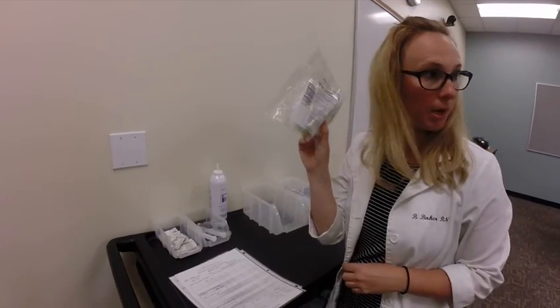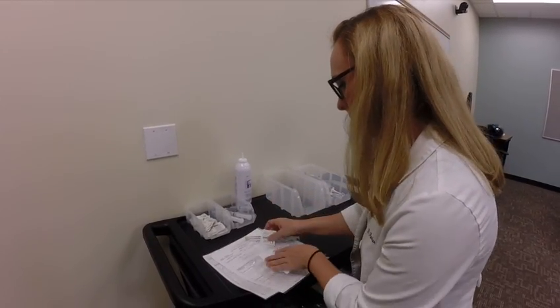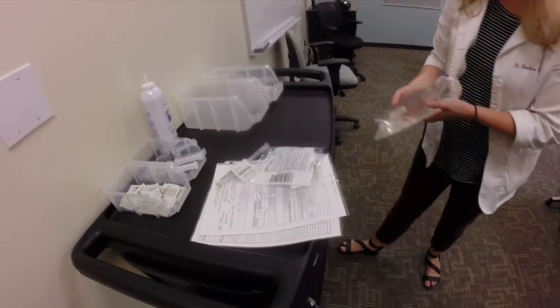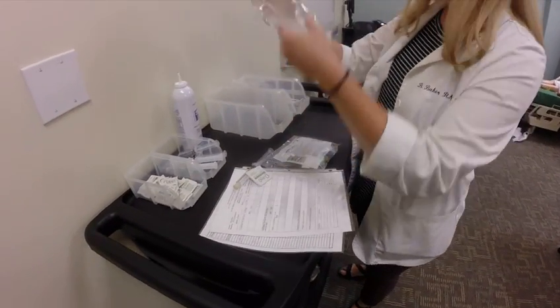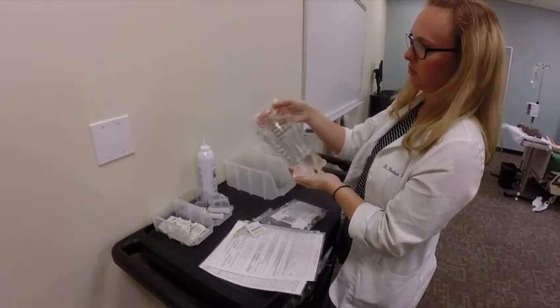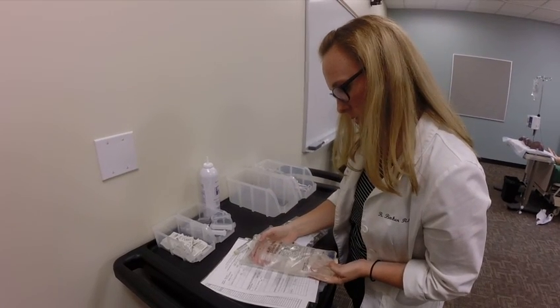I need a flush, and I need some alcohol, and then I'm going to pull my med. IV fluids, to me, are still a med, so I think you should do your three checks with it. Making sure there's no leaks, there's no sediment, and my expiration date is good. I'm doing my first check here.